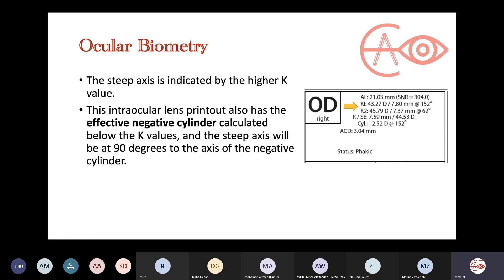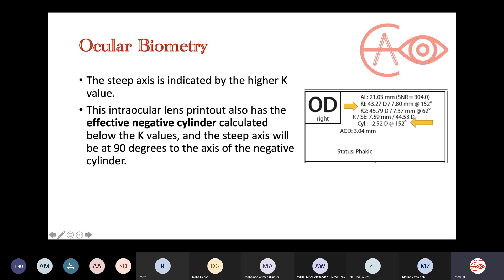The printout also gives you an approximate cylindrical correction needed by the patient. If the difference between the two K values differs from the patient's final cylinder, then there is lenticular astigmatism — astigmatism coming from the lens — which will be removed automatically when you do the cataract surgery and remove the crystalline lens. This is called the effective negative cylinder. The steep axis will be perpendicular to it, just like with glasses — the minus cylinder power acts on the axis 90 degrees away.